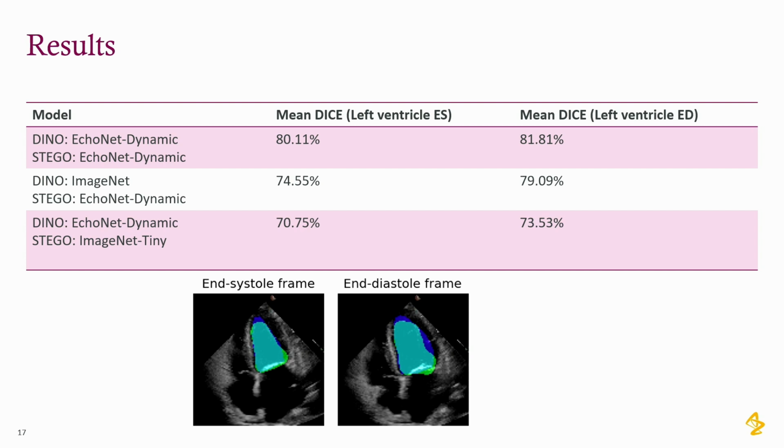To quantify this, we used the DICE metric, where 100% means perfect overlap and 0% means no overlap at all. And the mean DICE score of around 80% was what we acquired with this first idea of how we can do this segmentation. And that's a pretty good score.